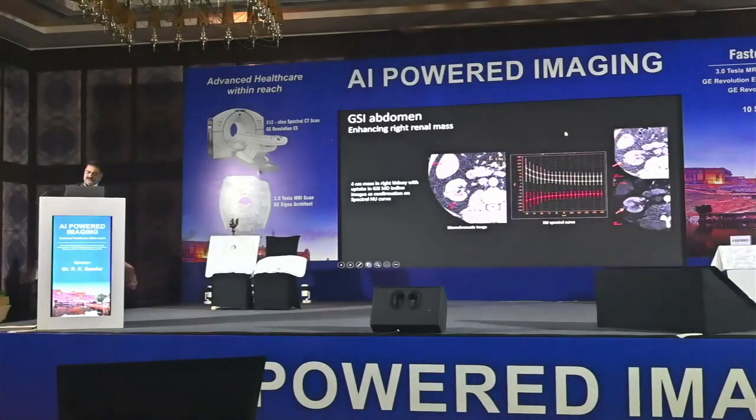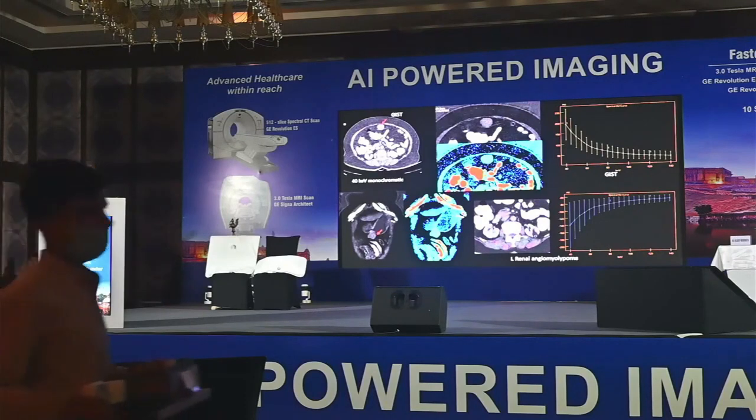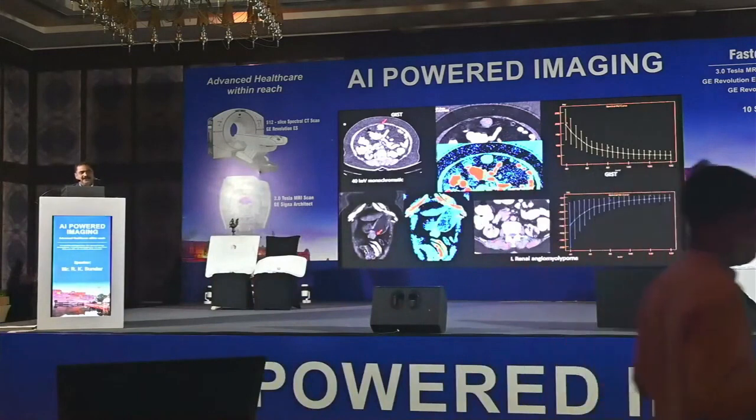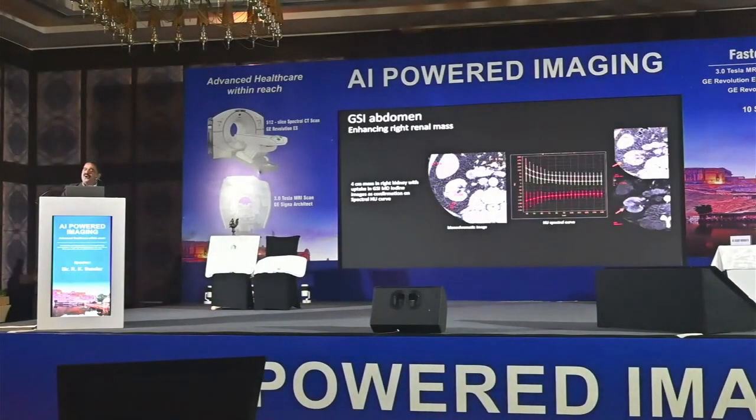And of course, she had something more here in the left kidney. We didn't really know what this was. The moment you put an ROI, it showed a fatty curve. So that is nothing but angiomyolipoma. So how specific spectral CT can be. In your routine case, when you're reading the image, you can make the difference of what this is. Rather than simply telling it's a cyst, you can now confidently say it is an angiomyolipoma.